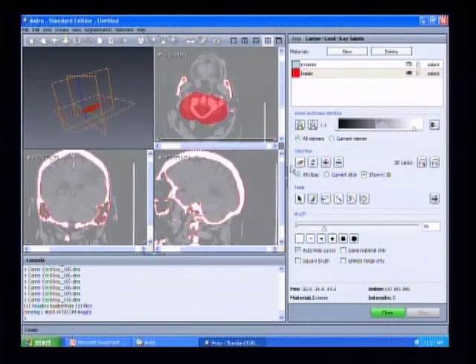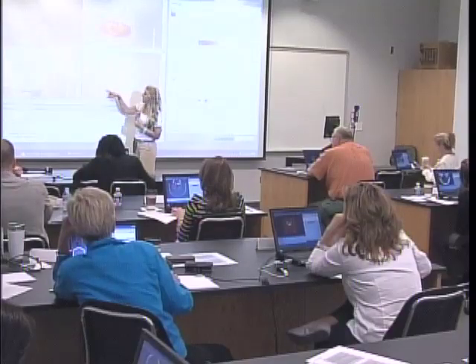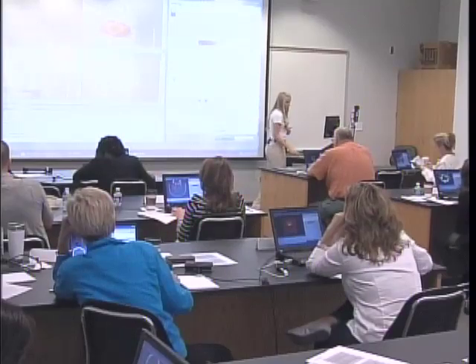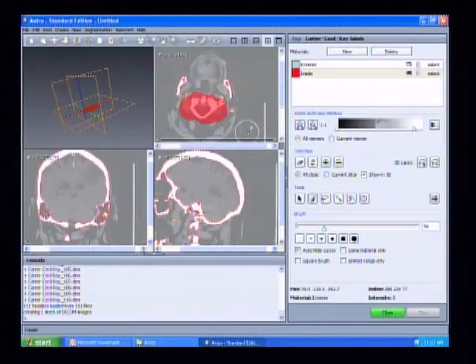Even though I did one slice, you can see in these bottom two areas where I've highlighted how it corresponds to these two slices here. I'm pretty far down, not anywhere near the base of the cranium. But when I highlight it in this one slice, I can then remove it, and it's no longer there.